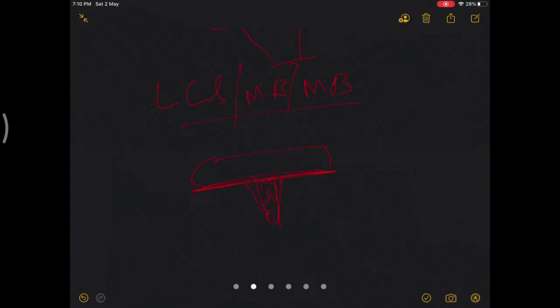There is no attachment of this poly to the tibial base plate. The proposed advantages are that rotations take place at the poly level and are not transmitted to the tibial base, so there is a theoretical advantage of lessened stress transmission and lessened tibial loosening.